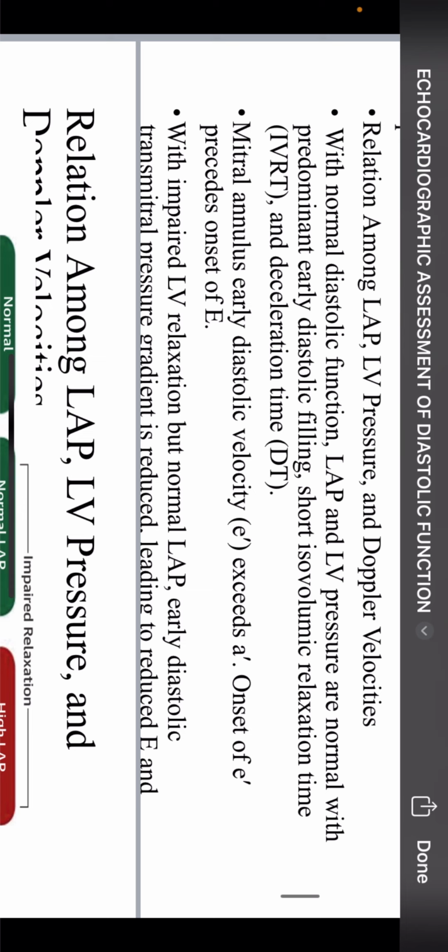When it's expanding, it goes upwards. On contraction, the annulus is pulled towards the apex. If it relaxes, the recoil, they go up. That movement going up is away from the transducer. It is negative. I think that one is finished. I'm not going to talk about this fluid challenge.